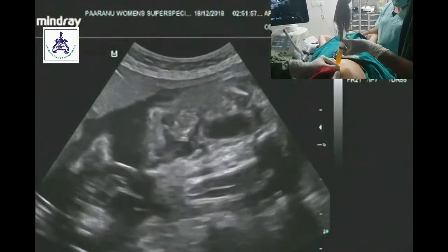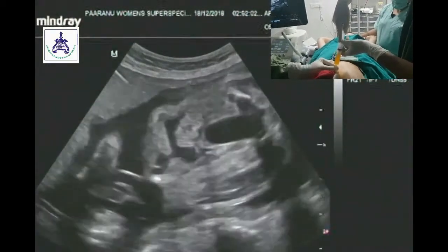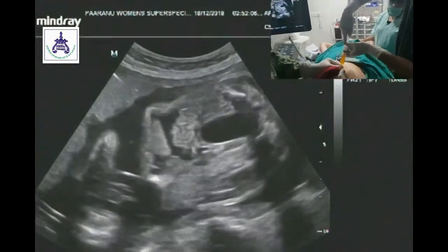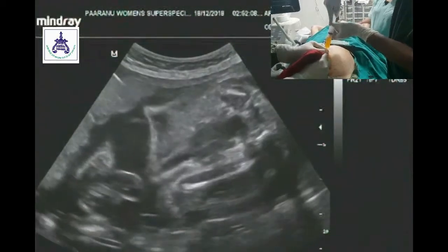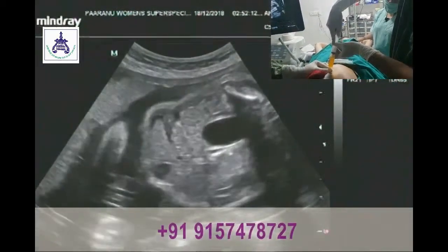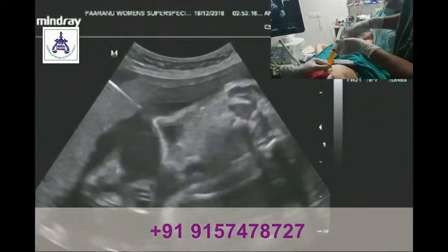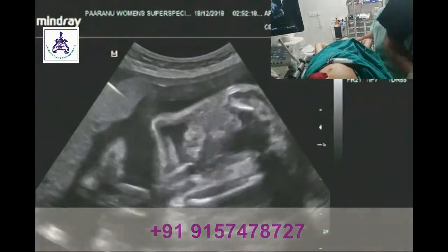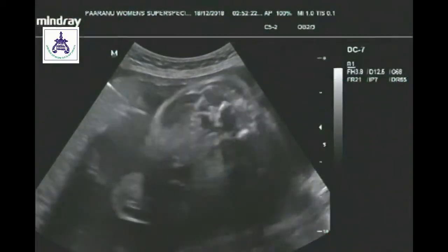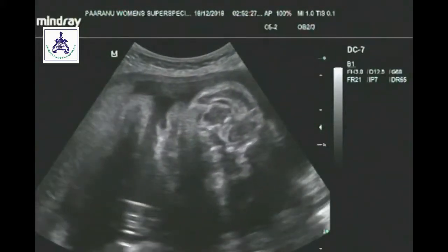Our needle tip is between the liver and the small intestine. You can clearly see the small depression in the abdominal skin. Throughout this process, our needle tip should be constantly in our vision. Now we have removed our needle, and you can see that the ascites has gradually come down to a much lower level.